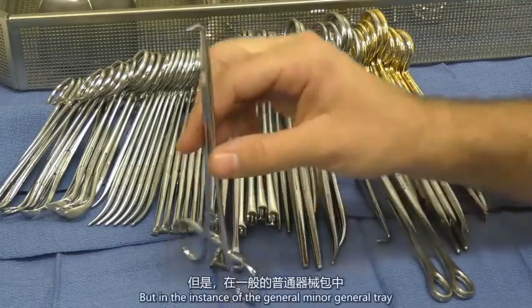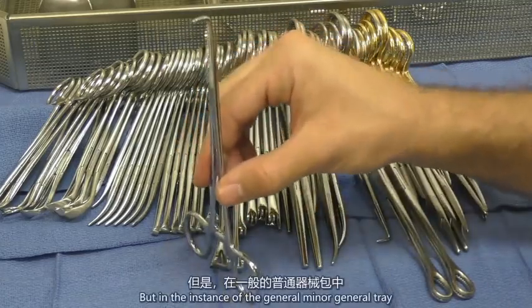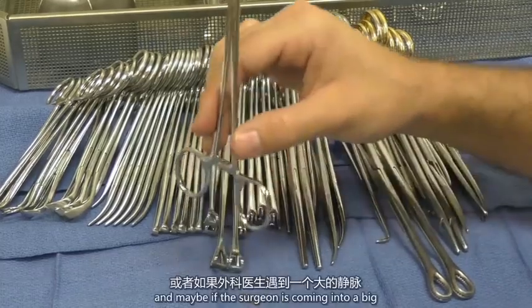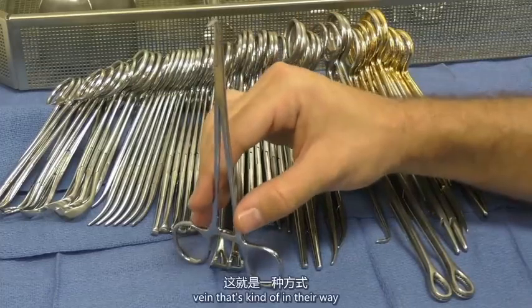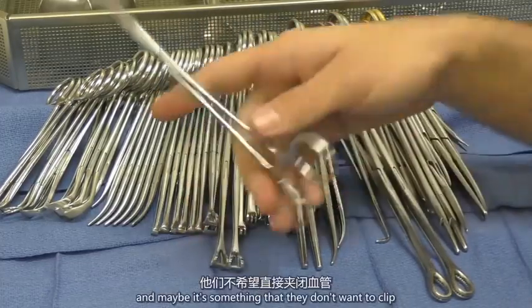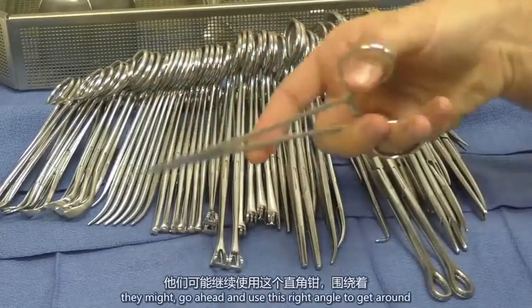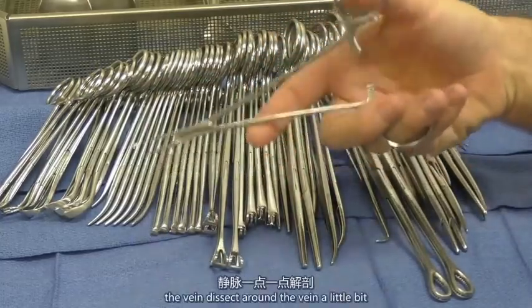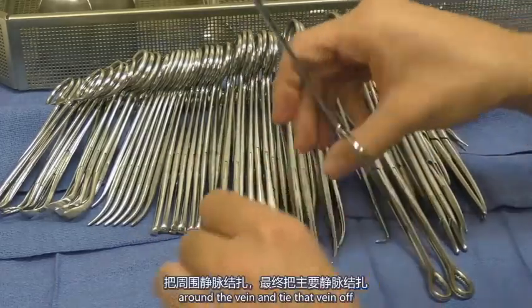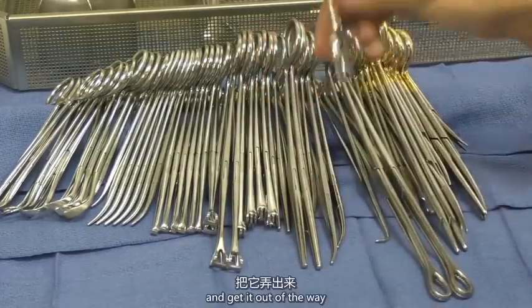But in the instance of the minor general tray, it could be used for dissection, and maybe if the surgeon is coming into a big vein that's kind of in their way, and maybe it's something that they don't want to clip, they might go ahead and use this right angle to get around the vein, dissect around the vein a little bit, and put a couple ties around the vein and tie that vein off and get it out of the way.